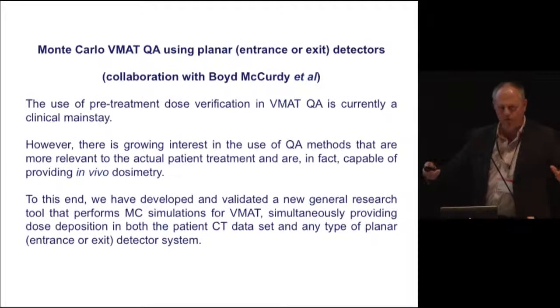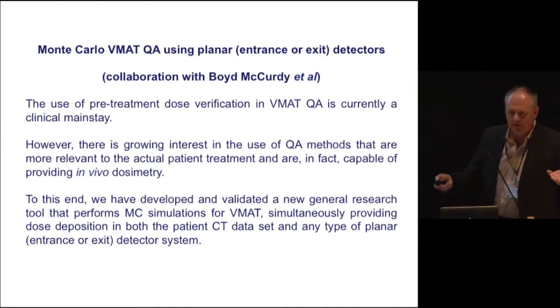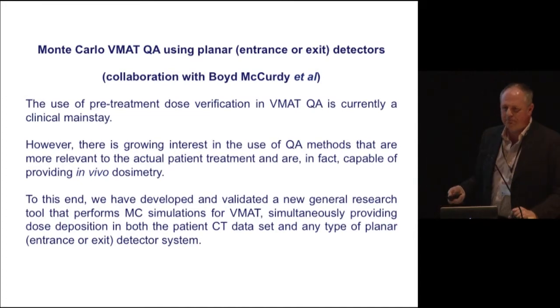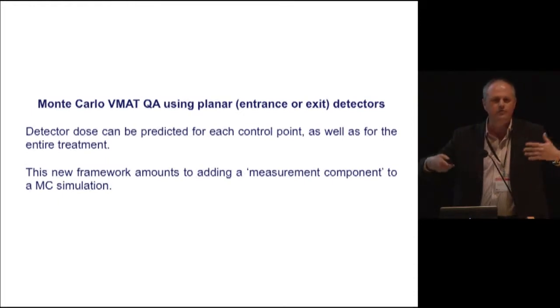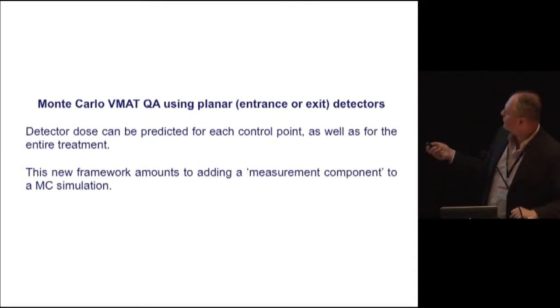And again, I want to make it very clear that conceptually this is nothing new because people have been using EPID in vivo dosimetry for many years, and Frank Verhaegen has been a pioneer in this field. This is just something that we are putting in front of the general BEAM and DOS-XYZ user. So it's something which will be very easy to implement by all users.